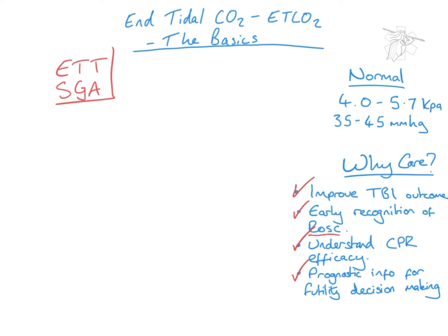We know what the normal ranges are now that we're looking for, the little numbers on your monitor. We'll have a quick look at just some of the waveforms that you might see. So certainly if you're using a monitor like a LIFEPAK or a Corpuls, as well as getting these numbers, you'll also get a waveform picture. And these can tell us a little bit of a story. So your normal picture we're looking for is this.